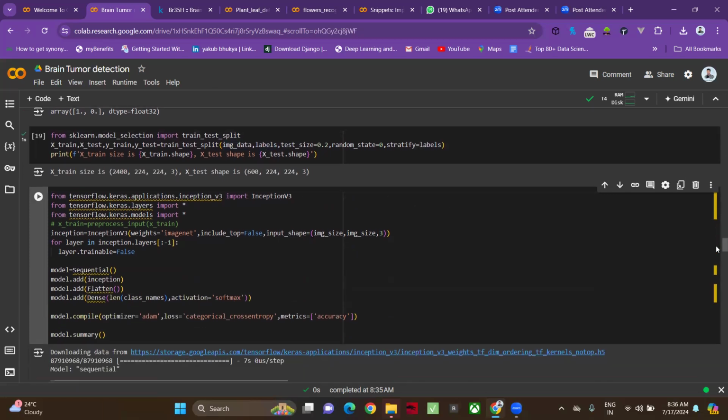Then next, we are taking help of the Inception V3 model. In this example, we are taking the Inception V3 pre-trained model. Whatever you see in a basic project, we created all the layers, applied the data, and finally observed the output. Whereas pre-trained models are predefined CNN architectures. We are taking help of a pre-trained architecture.